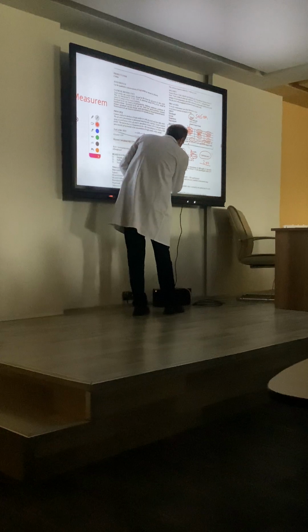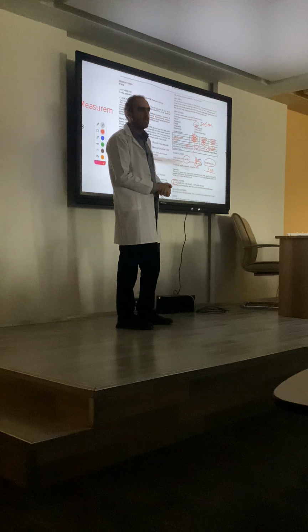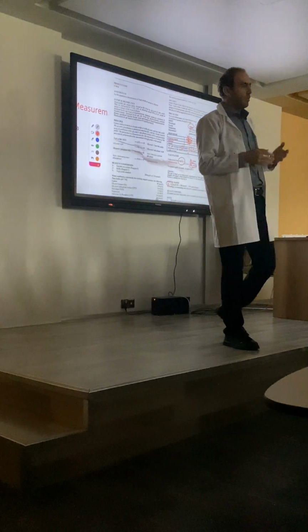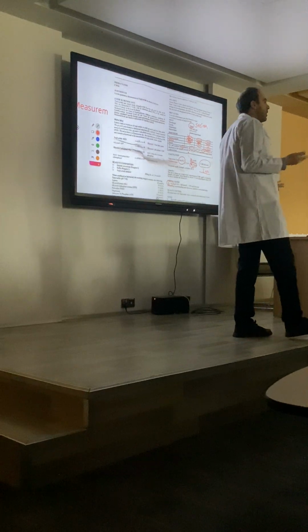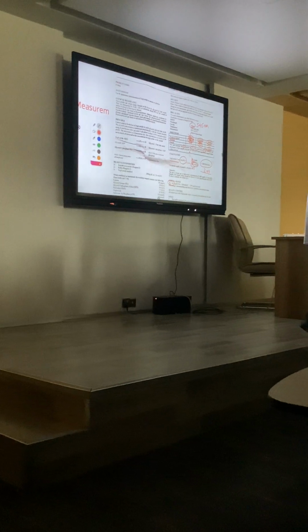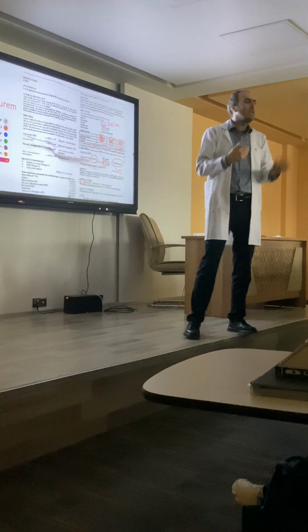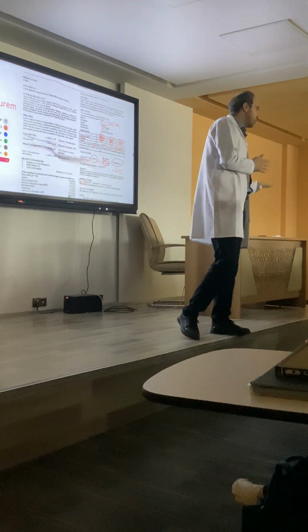The normal range is 36 to 165 milligram per deciliter. So if you get, for example, 5 or 0.2, it's wrong, exactly. But if you get 1000, maybe it's correct. This patient has hyperlipidemia. When you get a result out of the reference range, you have to do the test again, and you must be sure about the result, about your report.